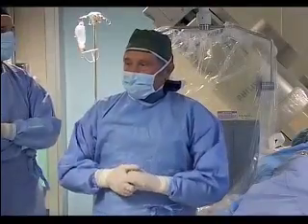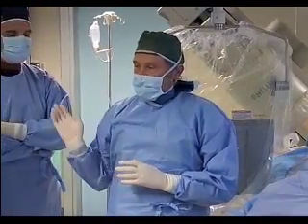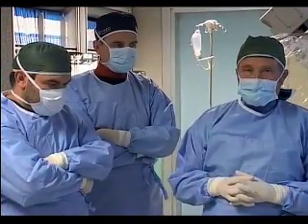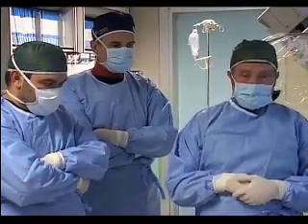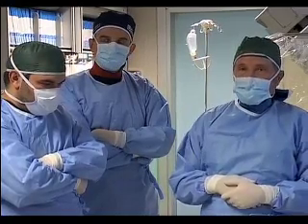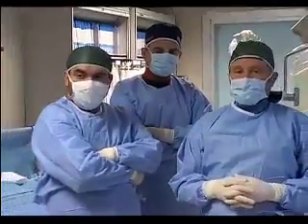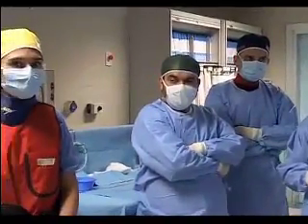Hello to everybody. I'm here with Massimo Chessa and Mohammed on my right side. We have a patient on the table with a PDA. And very briefly, Francesca Pluchinotta will introduce you the case. Please, Francesca, go ahead and introduce the case.